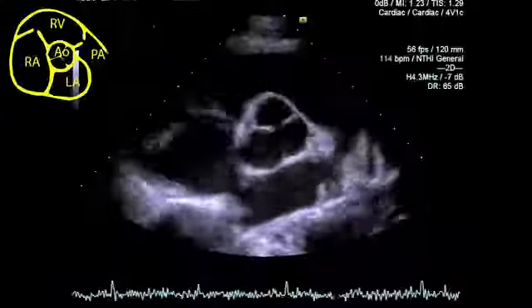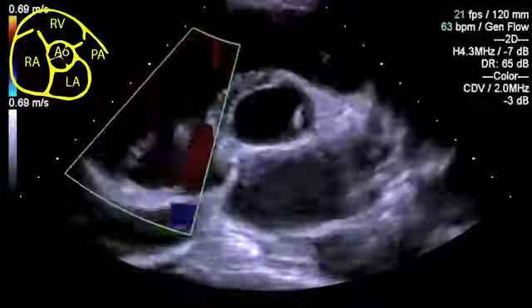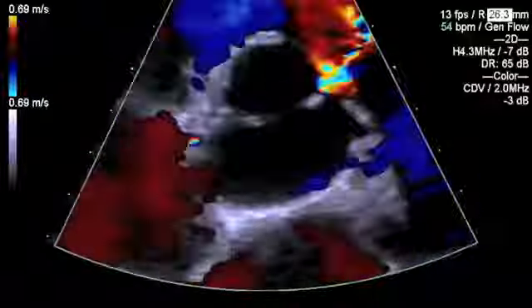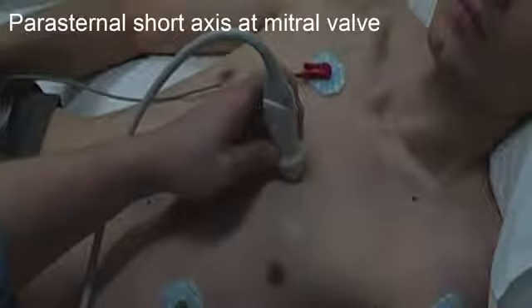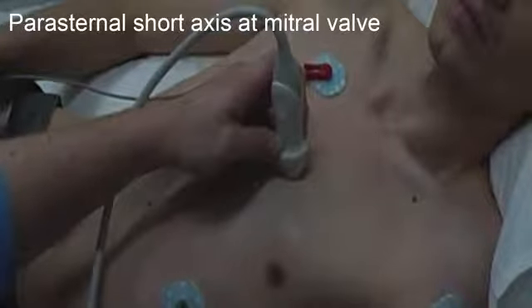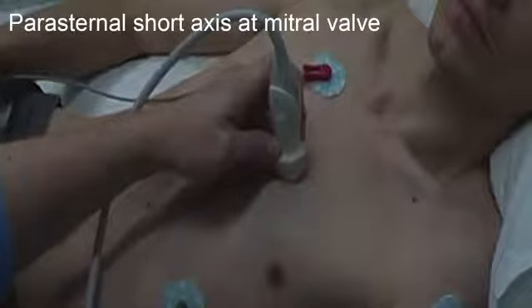Zoom in on the aortic valve to make an assessment. Apply colour flow Doppler to all valves to look for any gross valvular regurgitation. The next view, a parasternal short axis at the level of the mitral valve, is achieved by tilting the probe more inferiorly towards the patient's left hip.